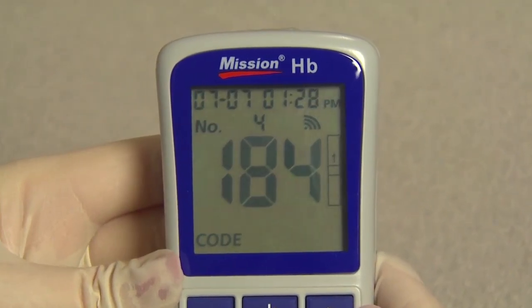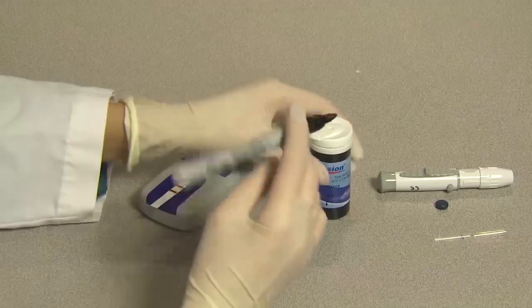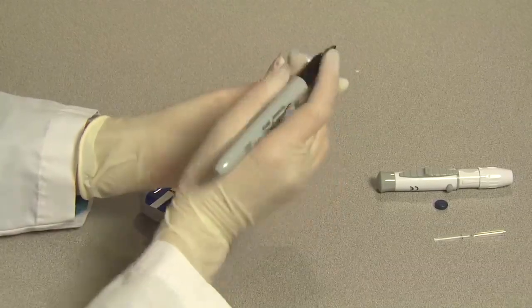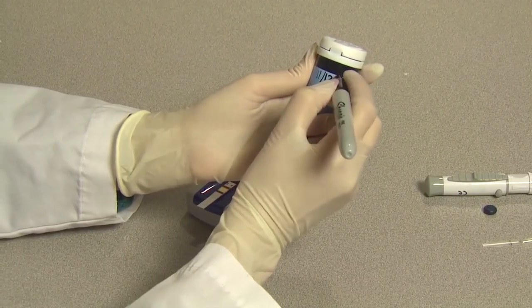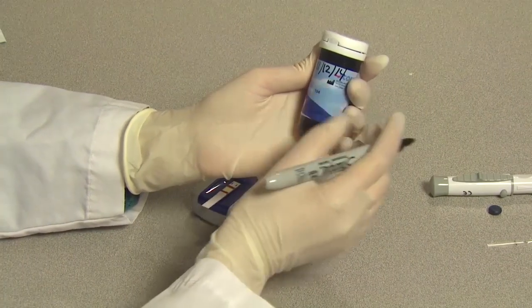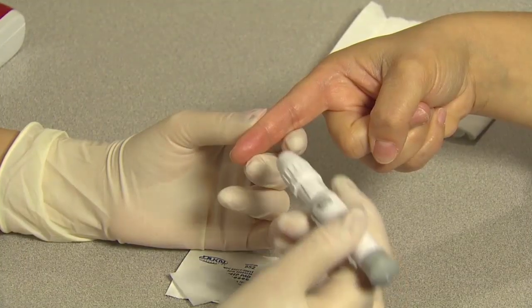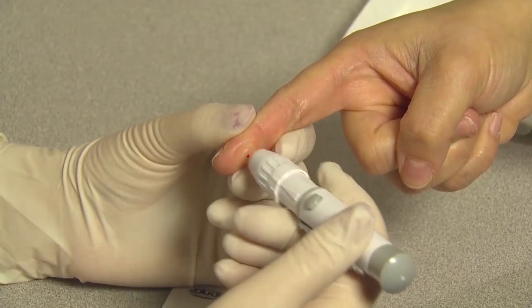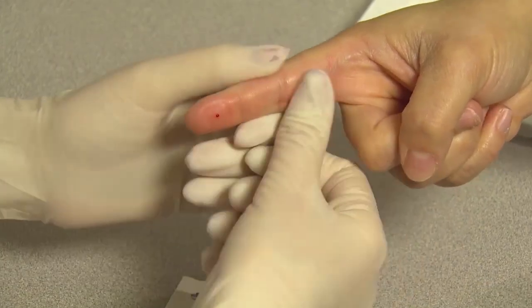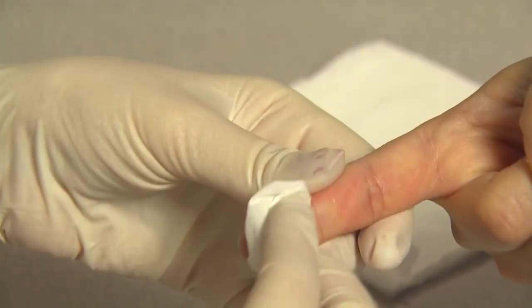The blood drop symbol will flash when the meter is ready for the specimen to be applied. Make sure you write down the date on the canister if opened for the first time. Discard the canister and test strips after three months from the date the canister was opened. Hold the lancing device against the side of the finger to be lanced with the cover resting on the finger. Push the release button to prick the fingertip. Gently massage the surrounding area toward the puncture. Do not excessively squeeze the finger. Wipe away the first drop of blood.